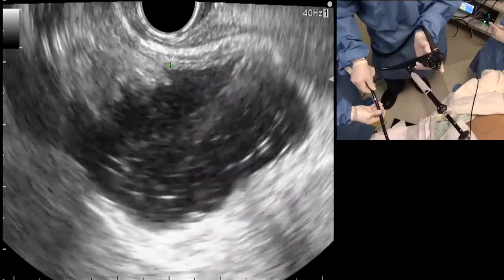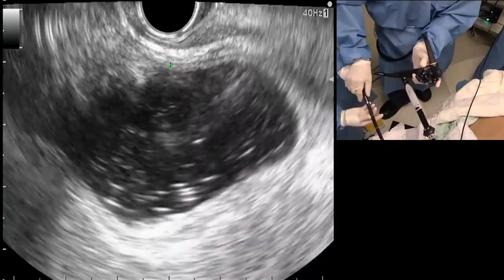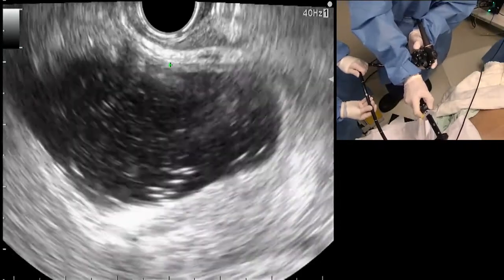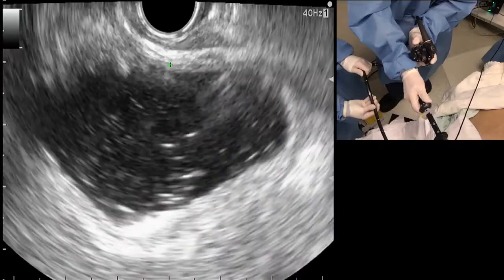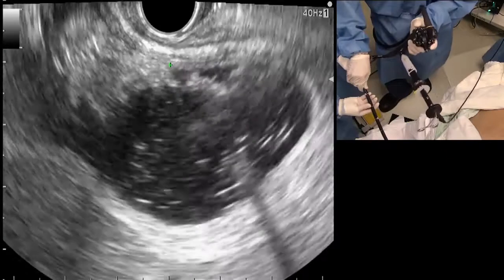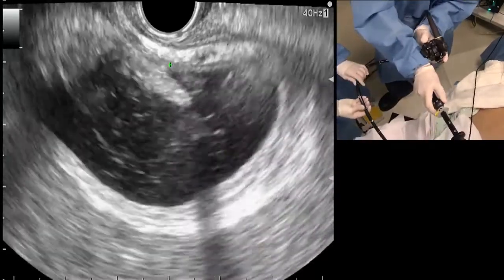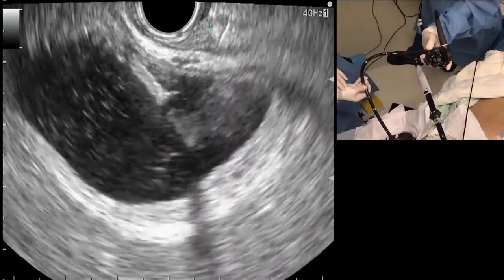Now, this is why the learning curve is so long with interventional EUS, because when you're torqued as you are in the duodenum now, in the long position and everything, things go off axis. So I'm advancing. We see this, of course, with FNA needles too. So even though I'm advancing this, I don't see the sheath so well, right? So I maybe have to get into a different plane to see where the sheath is. And I really want to see that sheath well. So I've got to figure out why I'm not seeing that sheath, the double tram track. There it is. I'll point it out to you just in case you don't see it. It's right here.